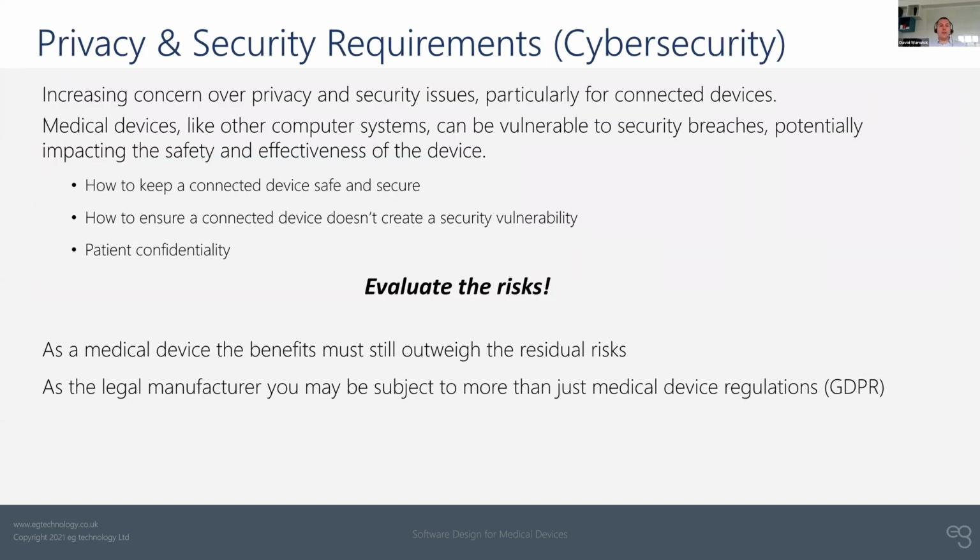So cybersecurity is a really hot topic at the moment, because there's very significant concern over privacy and security issues, because so many new medical devices are now becoming connected. And what we're seeing these days is that everybody who makes regulatory submissions has to have a very robust section on how they address any cybersecurity concerns.